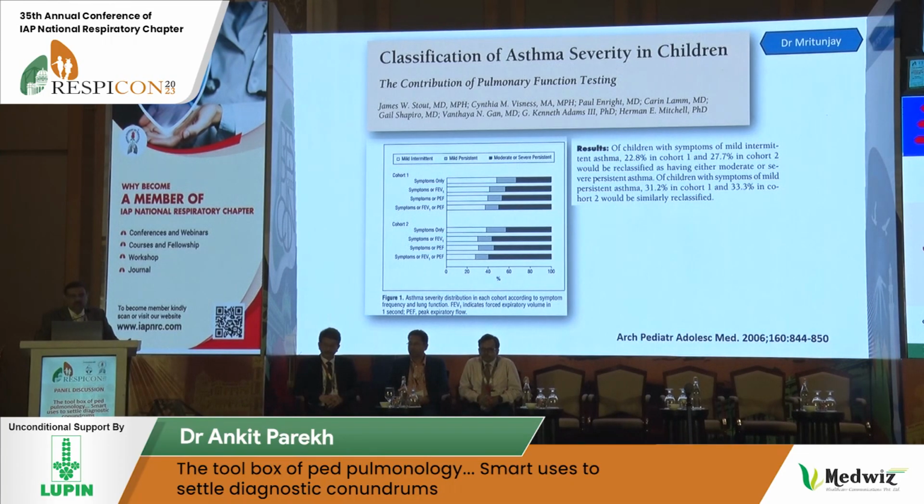So we have data, and this is a very old study. Why am I showing you this old study? Because this question is no longer being asked. Most pulmonologists will not be asking whether you actually need to do spirometry in follow-up. Because it is not being asked, it is not researched now. But this is good old data which shows that if you add lung function or spirometry to your clinical assessment, you are going to upscore your asthma.